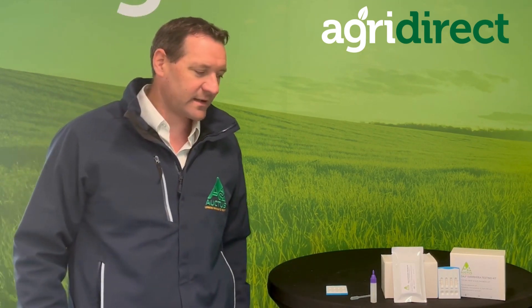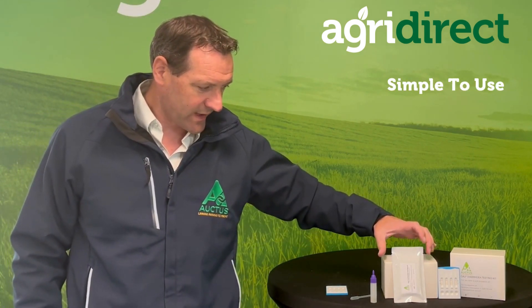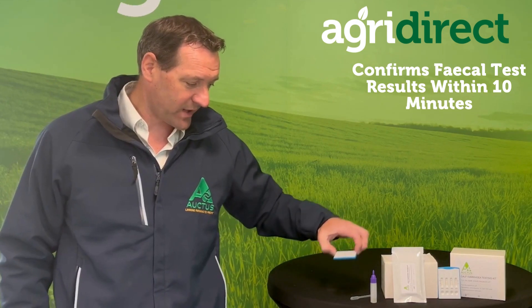The test kit itself is very easy and very straightforward to use. Basically, what we have here is our sealed pouch which contains our cassette. When we're ready to test, we open the pouch and leave the cassette on a flat surface.